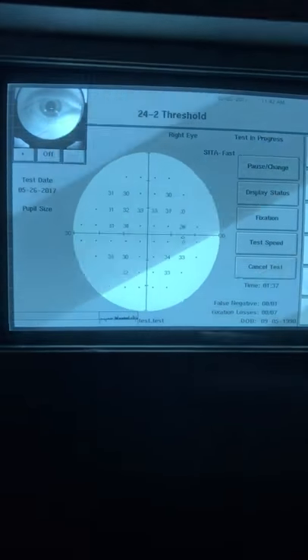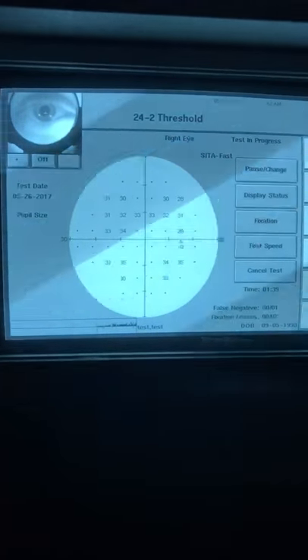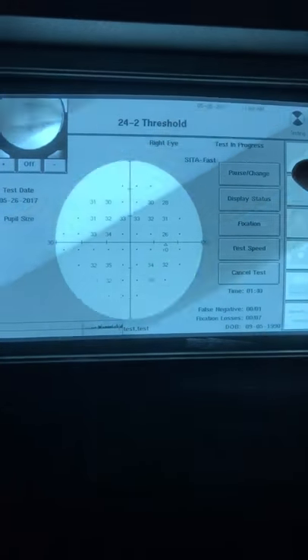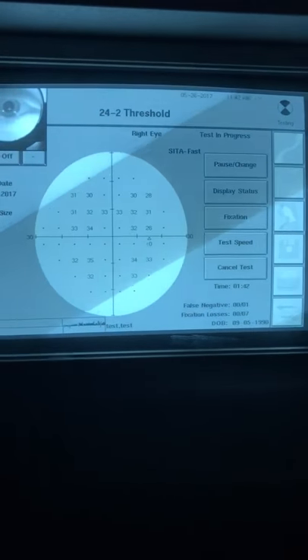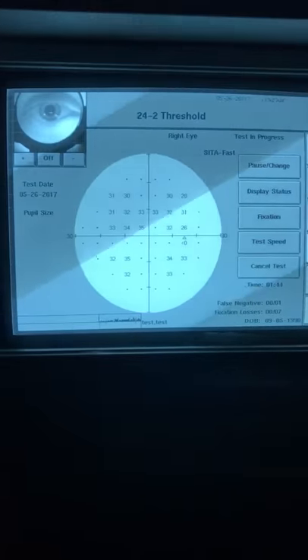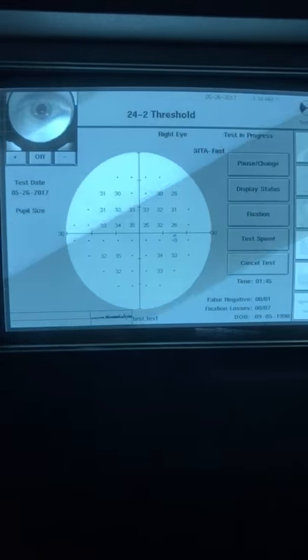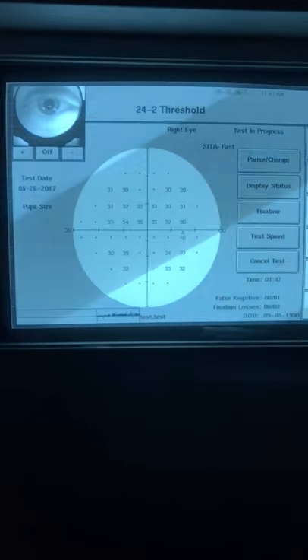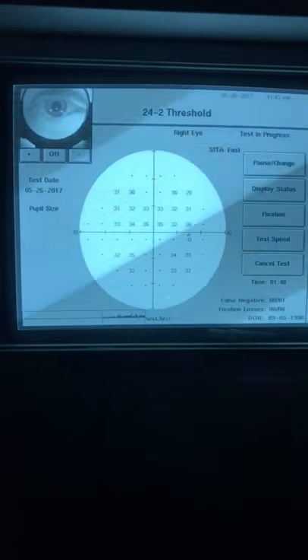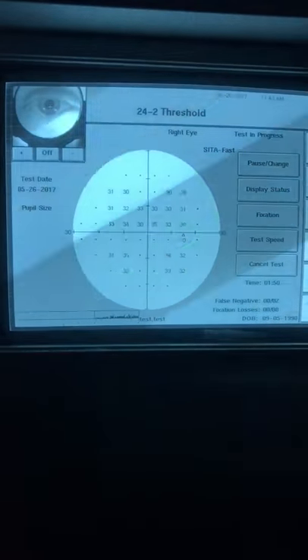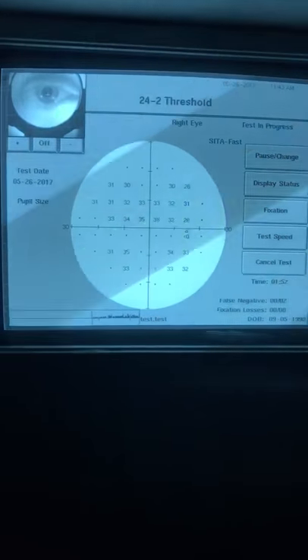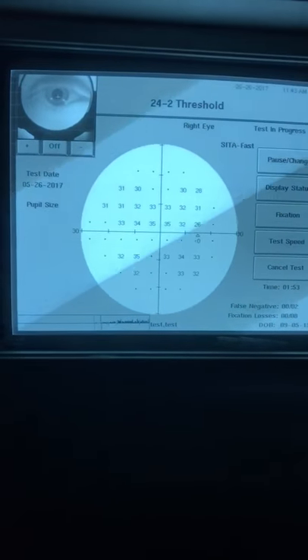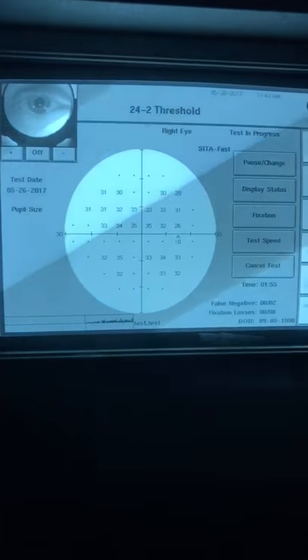If you ever see a fixation loss, you want to pause the test, which you can pause here. Or they can hold that button down for two seconds or more. Then just look at their eye and see if the patch is covered, make sure they are lined up properly, and go over the instructions again to only click if they're definitely seeing those lights.